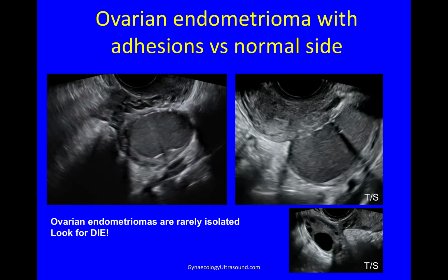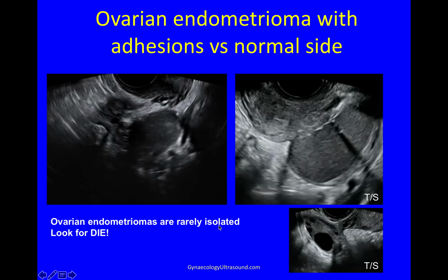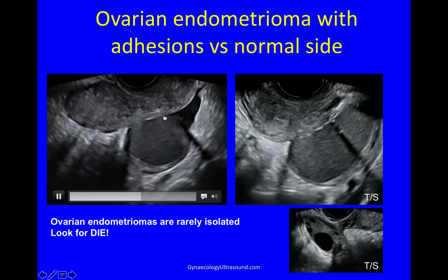In this video, you can see an ovarian endometrioma, and it is adherent to the uterus, to the back of the cervix. You can see it there.